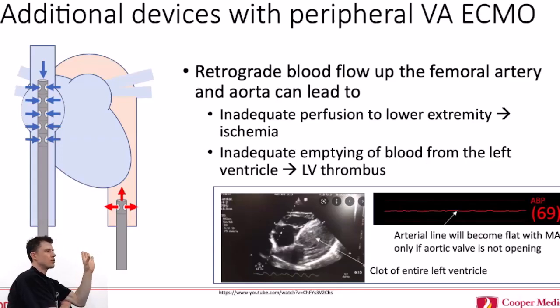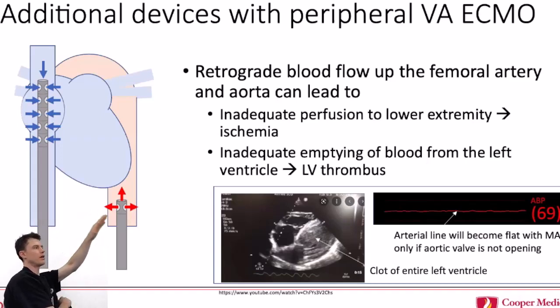As the heart recovers, it's going to start ejecting more, and so the systolic will go higher. There'll be a bigger difference between the diastolic and the systolic. So that's one thing. Anything else you guys think about? No, I mean, you'll echo, start to do bedside ultrasounds, and then wean your support and watch the heart take over the work.